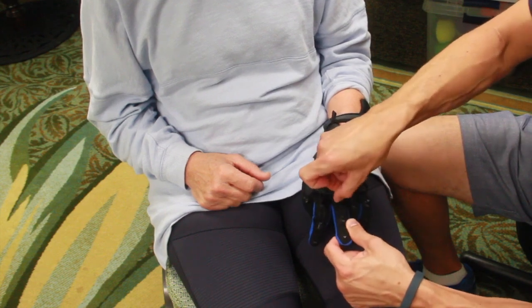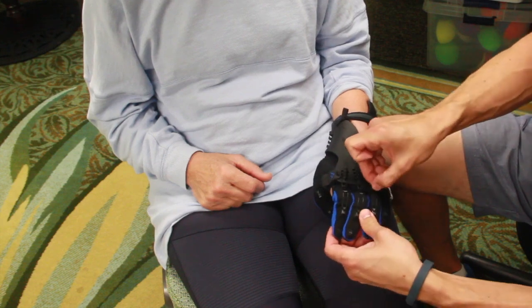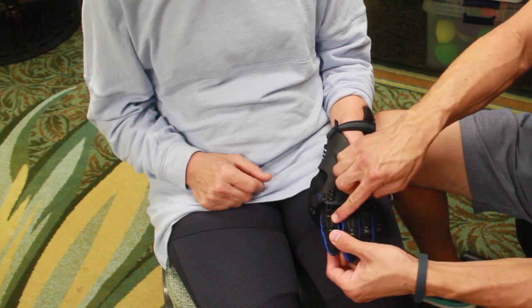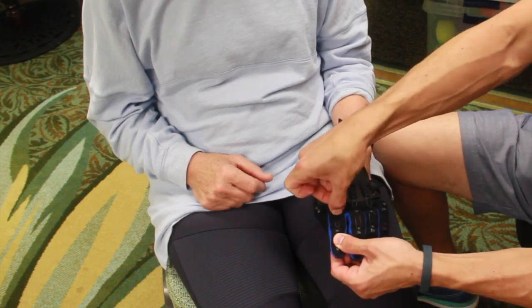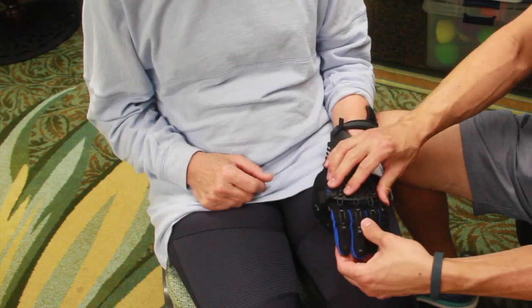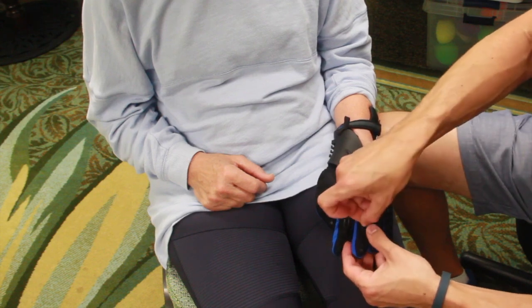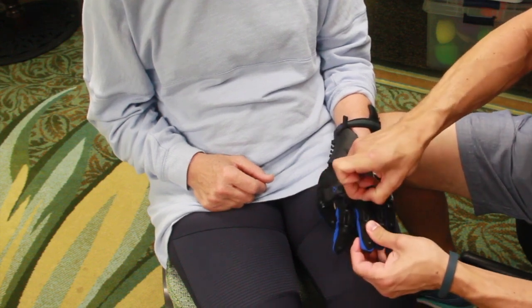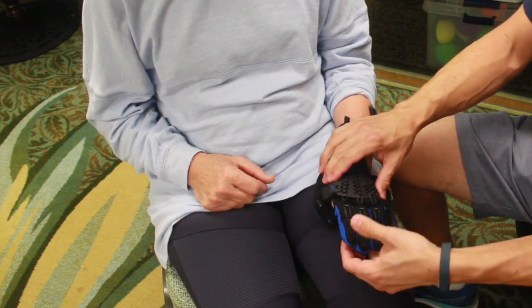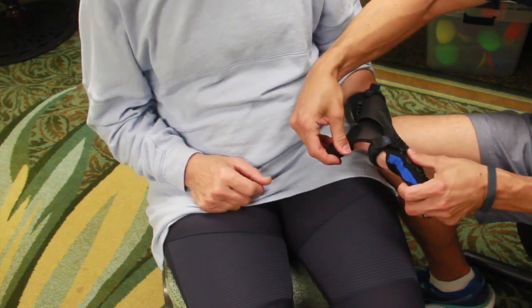And not every joint needs a tensioner, and not every finger needs a tensioner. So here I'm applying tensioners to the middle joints to give us straightening of the fingers at the middle joint. You can even double up. On the pointer finger, you'll notice I added 2 tensioners to the middle joint, which is the PIP joint, to give it more extension. So I'm going to do that also with the middle finger as well, and just by pulling and attaching. So the hooks can accommodate 2 tensioners.